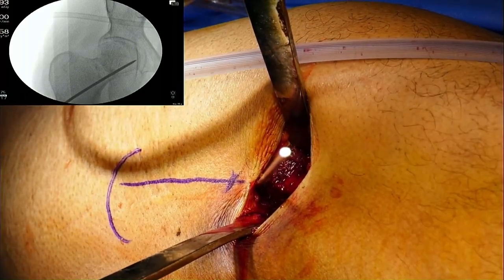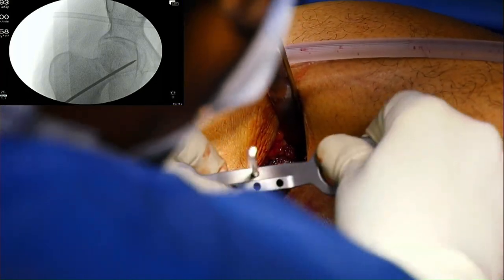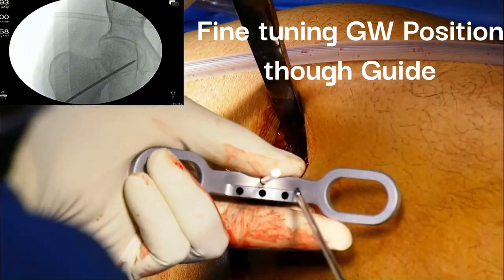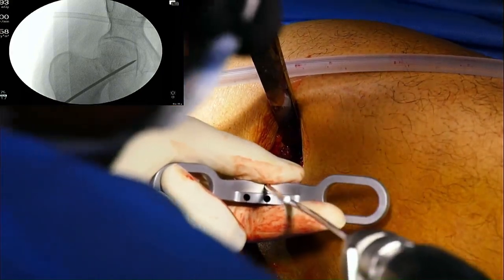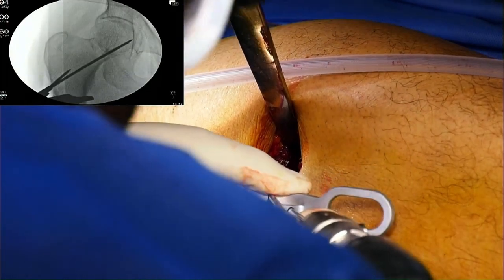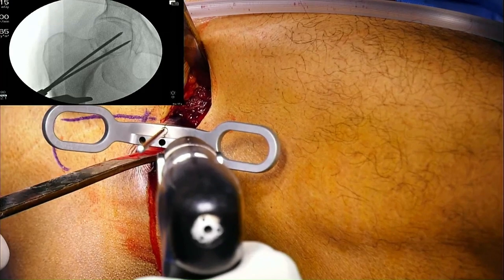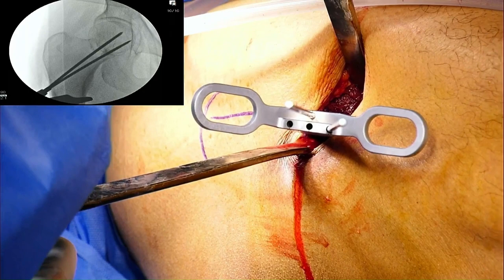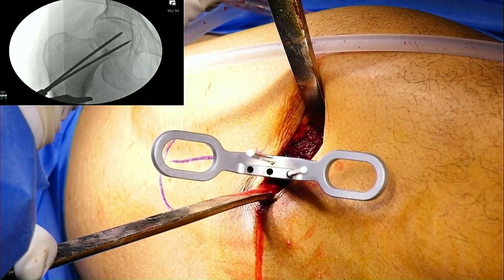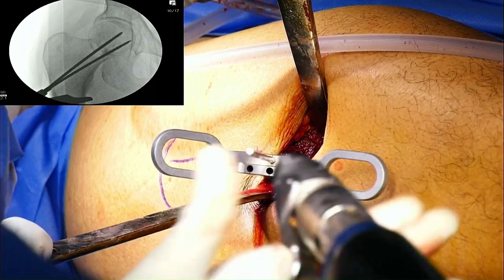I apply this instrument and slightly go superiorly — I'll plan to go about 15 degrees above. Shoot — it is going more inferior. Okay, take the lateral picture. This is in the center at 135 degrees. Actually the earlier one had gone a little varus, so I am more happy with this guide wire in AP and it seems to be fine in the lateral picture also. I'll just withdraw the earlier one and see.